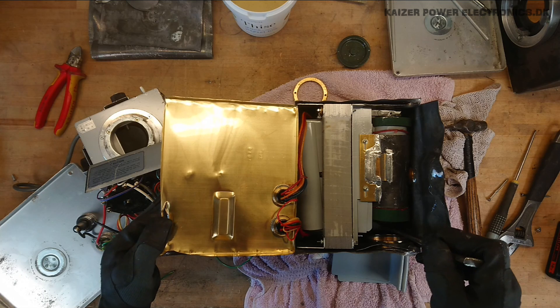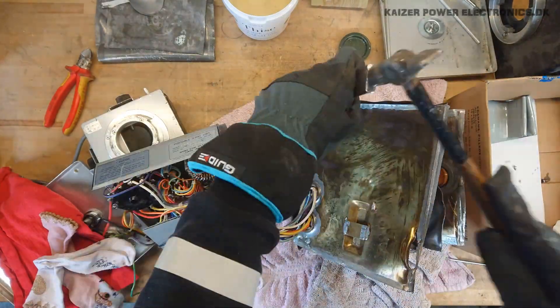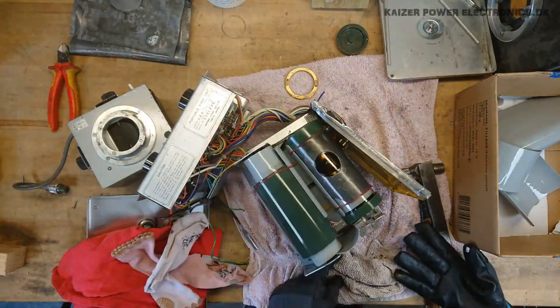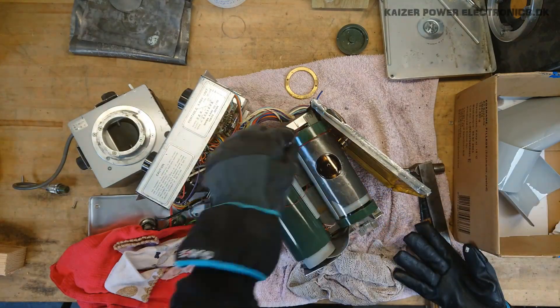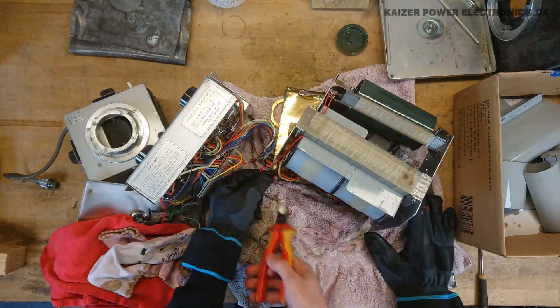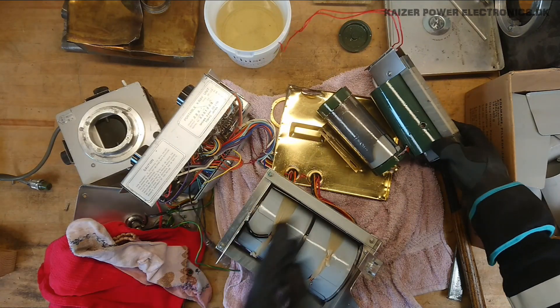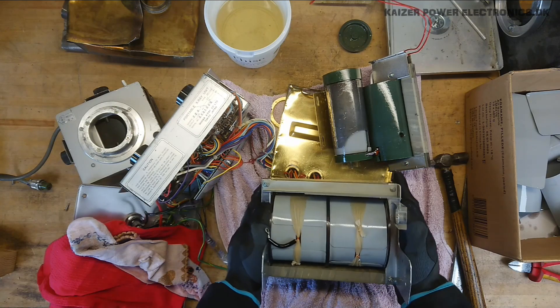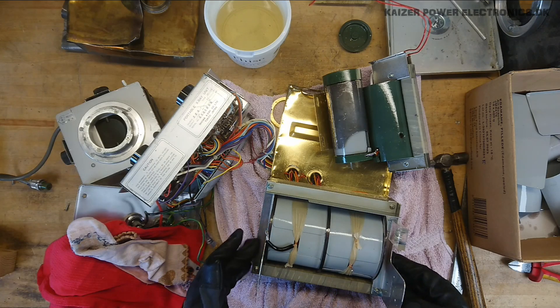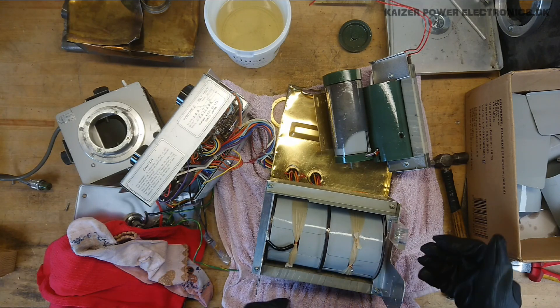So perhaps once I get all this out, we can see the multiplier. Everything has come apart. So we have a transformer — mains fed, most likely center-tapped, where the core is the center tap. And that is usually done in order to minimize the potential difference between your high voltage winding and the metal core.